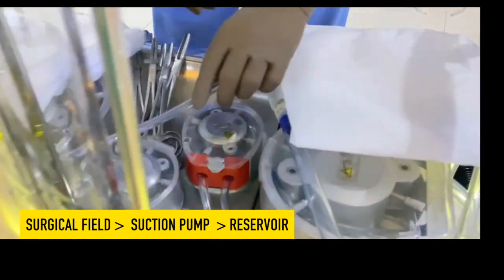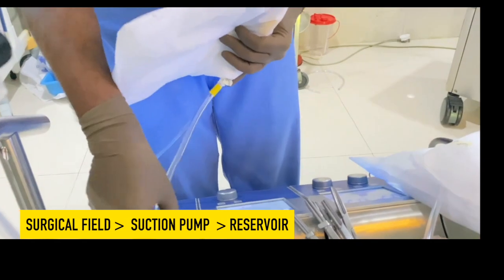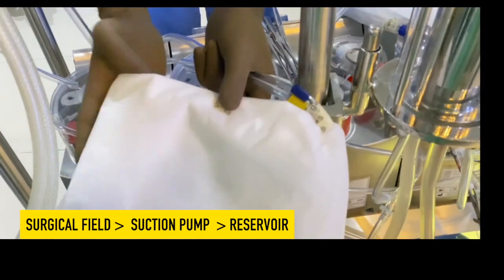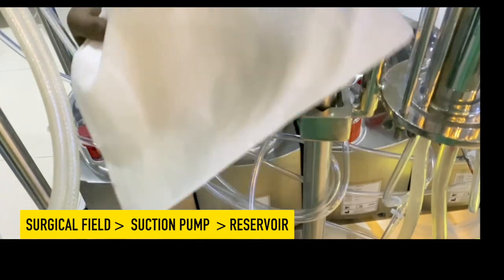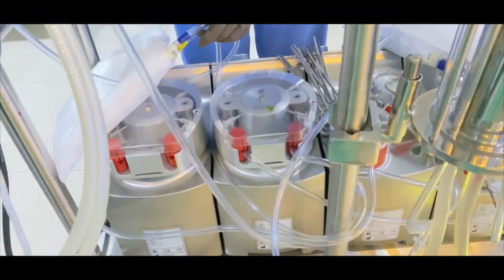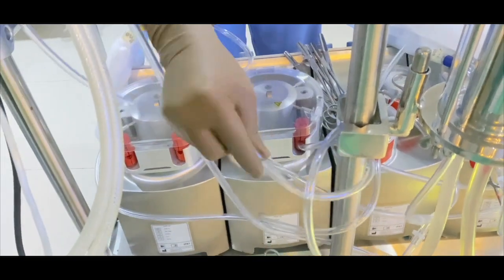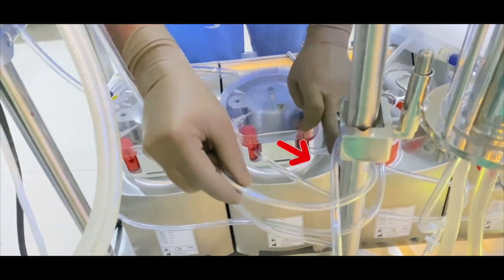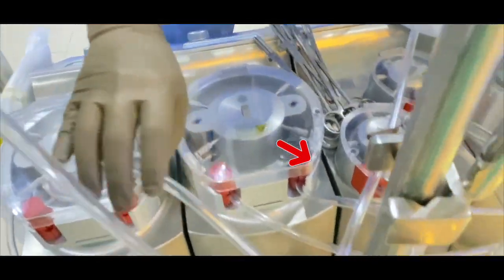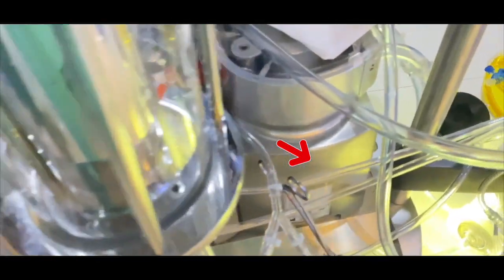Suction line. Suction line receives blood from surgical field and it will work as a vacuum. Both lines will again connect to the reservoir for the purification. The blood will receive from surgical field and the pump will provide this blood to reservoir for the purification.